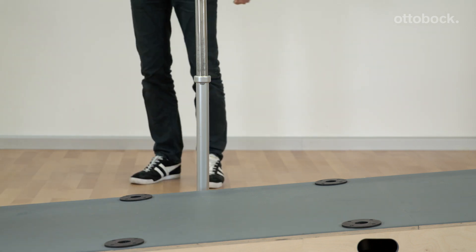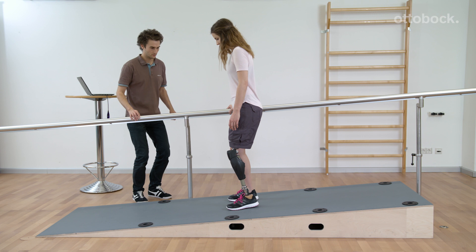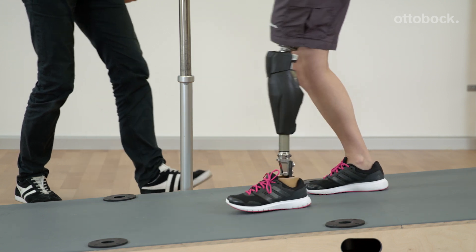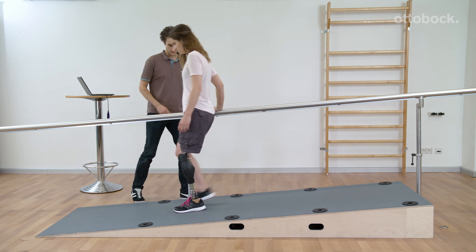A lot of unilateral users also like the added stability. To exit the deliberate stance function, at least one of these two criteria has to be met: 1. Unweighting of the prosthesis, or 2. Extension of the knee joint.